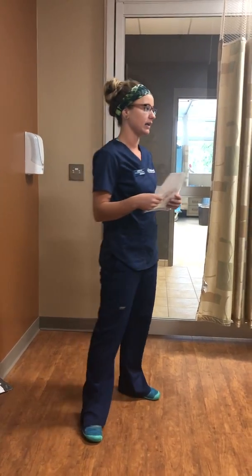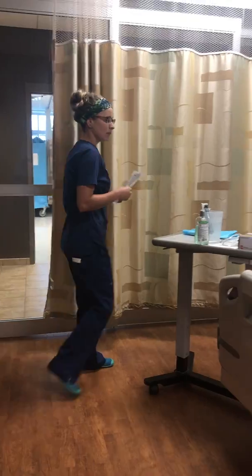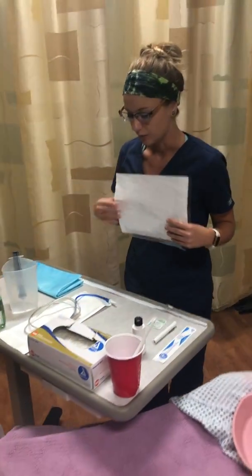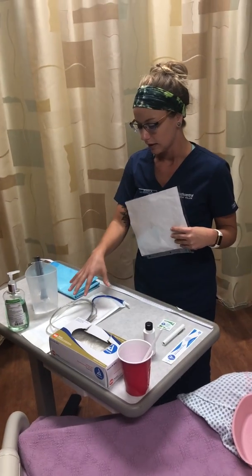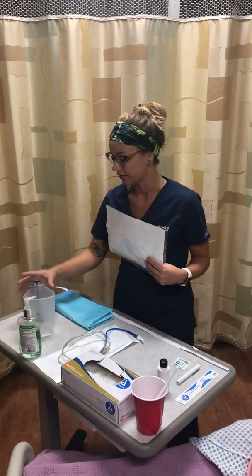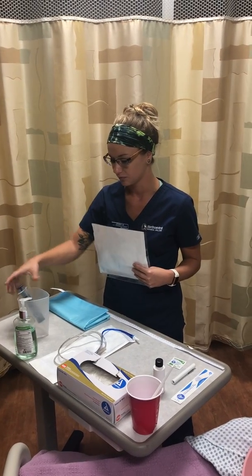So I'm going to go ahead and prepare my supplies. I want to make sure that I have the right size NG tube. I have the right tube here, a Salem Sump NG tube. I have a 60 cc syringe.